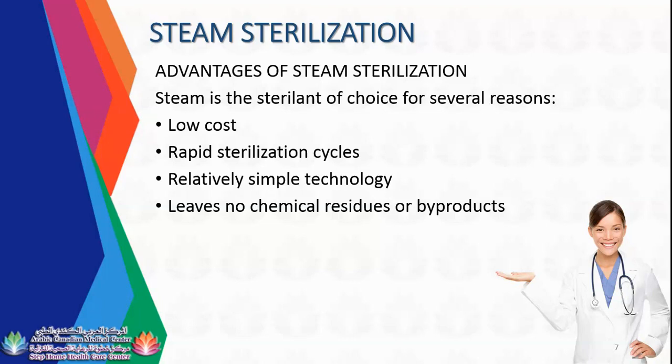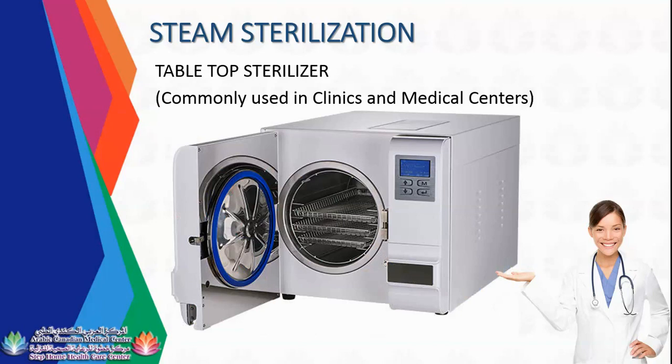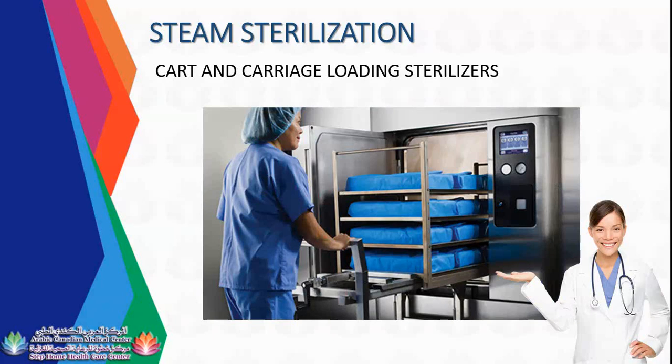So the tabletop sterilizer is commonly used in clinics and medical centers, but the same protocols, even in small or large autoclave machines, have the same protocols and procedures. In the hospital, this is the commonly used cart and carriage loading sterilizer. It is an autoclave. Floor loading sterilizer.